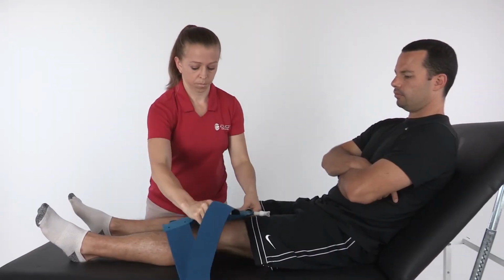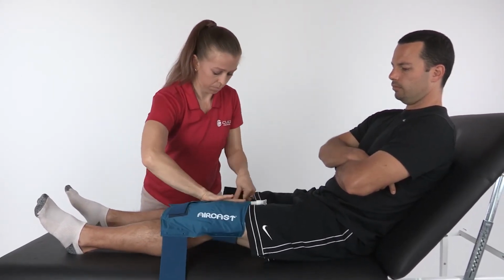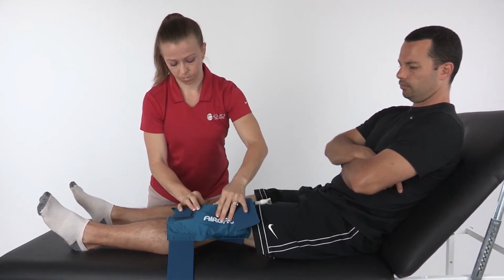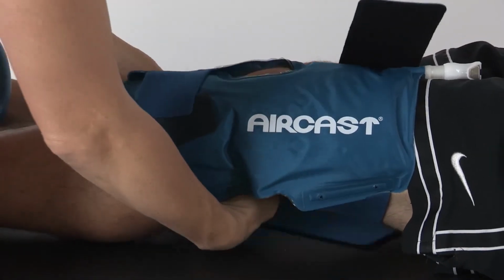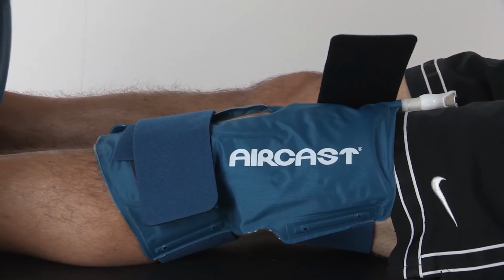Knee application. 1. Make sure that your cuff is empty prior to application. 2. Place the cuff on the front of the knee and secure the top strap. Top strap should be snug, but not tight. 3. Adjust the front opening. Your kneecap should appear through the opening. 4. Apply the bottom strap loosely.